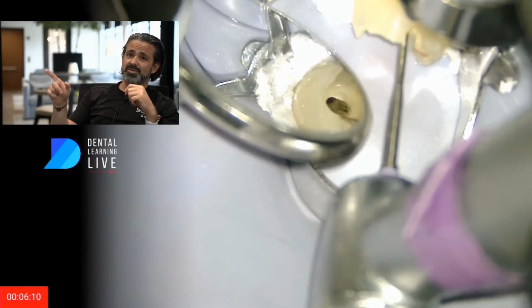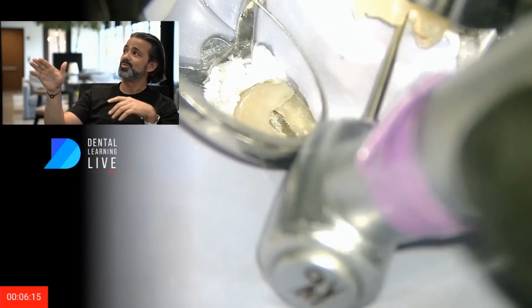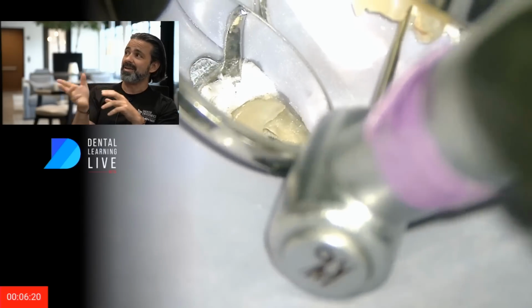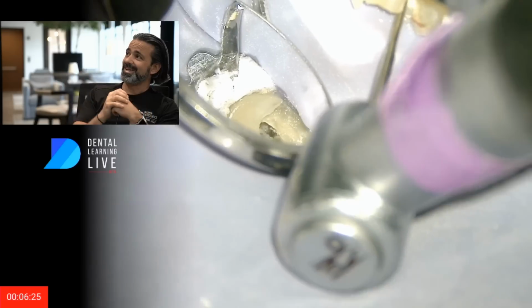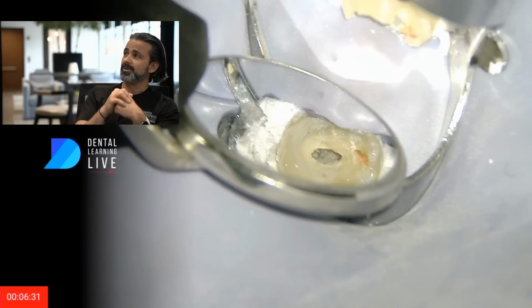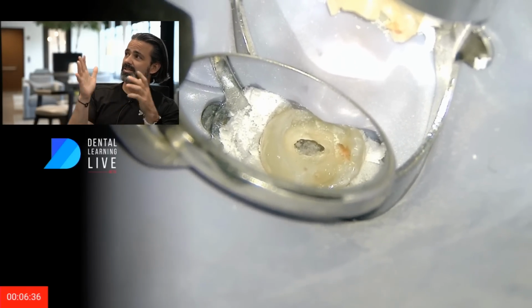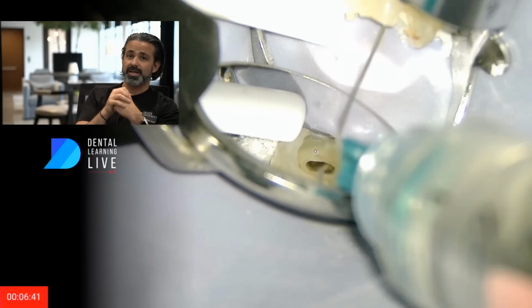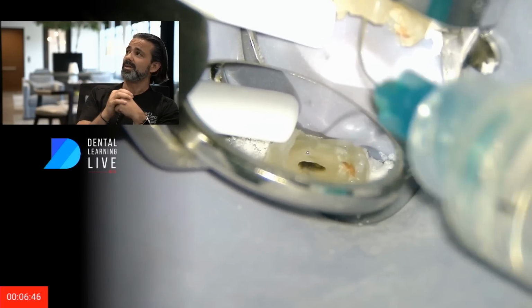So I'm going down to a smaller burr. Another option, and admittedly, you use what you like, you could use an ultrasonic, and in some ways it might let you see around it a little bit better, and it might actually flick up the stone. But sometimes I use whatever my assistant hands me, and this was really small. It's the purple of the Munspur, and trying to clean that up a little bit creates a lot of debris when you do it this way. So we're going to try to flush that debris up and take a look at it and see if I can now get into that little lip that's blocking me out.